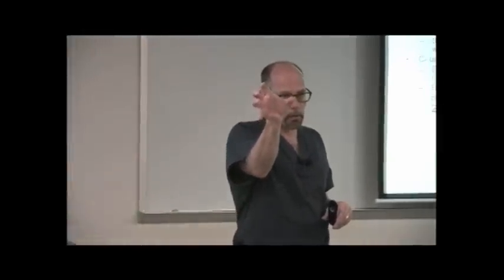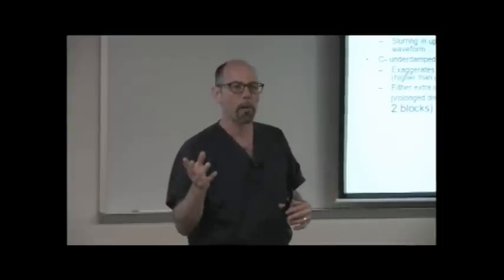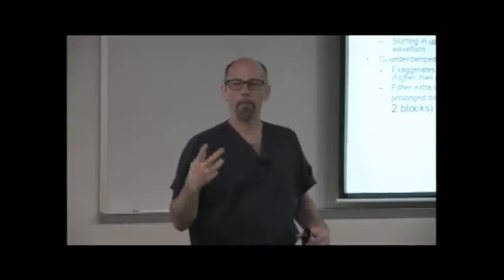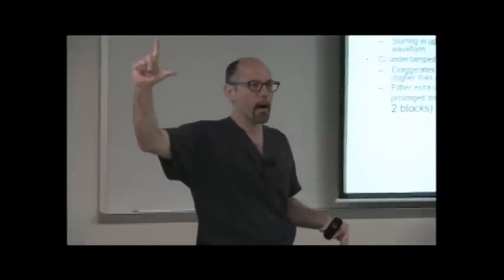Not pumped up to 300 millimeters of mercury. So what happens when that pressure bag starts to empty out or causes the pressure to go down? That transducer is dependent on 300 millimeters of mercury pressure in order to keep it infusing at 3 mLs per hour. All right, there is a little valve that opens up when that pressure bag is at 300 millimeters of mercury that allows 3 mLs per hour of flush through the system. A different transducer might do 2 mLs per hour. A pediatric one does 1 mL per hour. The idea is, though, that the pressure still has to be behind the system in order to keep that flush going through the system. All right?